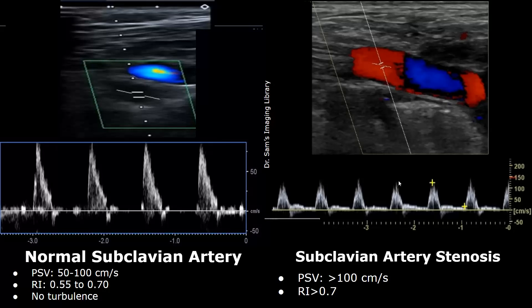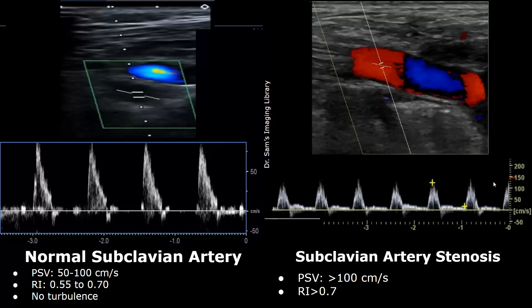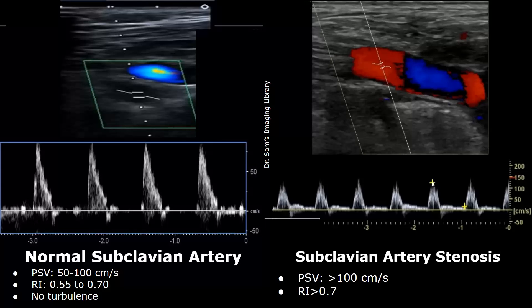Here we have a case of subclavian artery stenosis. There is narrowing of the lumen of the subclavian artery. In such cases, the peak systolic velocity will increase — it will be more than 100 centimeters per second. Here it is almost 150 centimeters per second. The resistive index will be greater than 0.7.